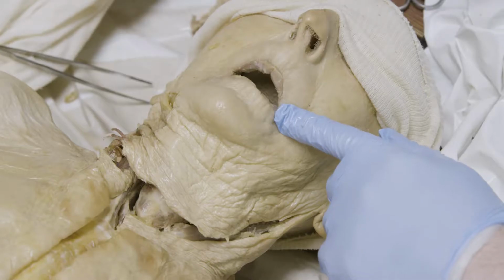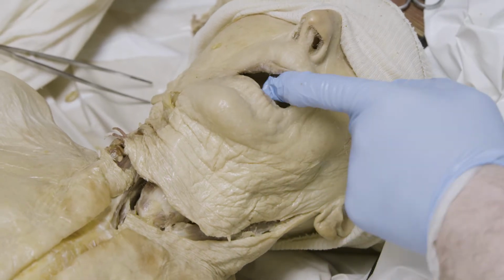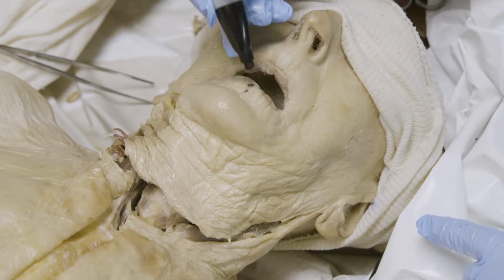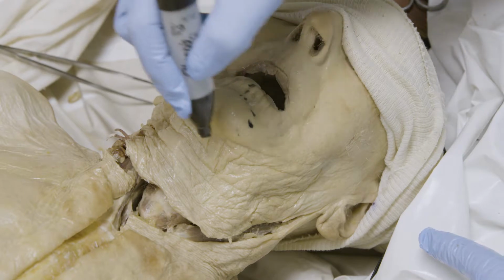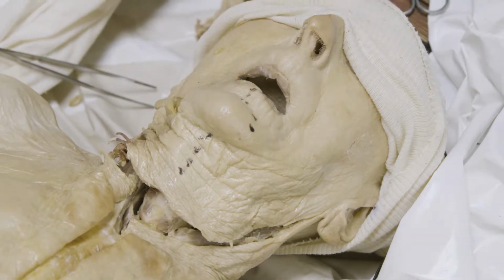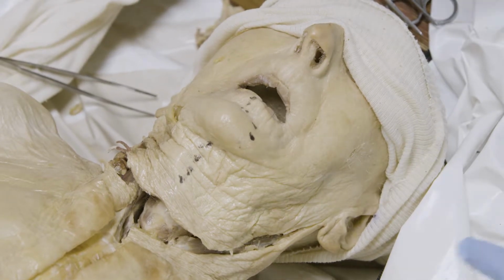To approach the oral cavity, it can be difficult to get the tumors out, in this patient especially because she's post-mortem, everything is very tight and rigid. So what we're going to do is basically what we would call a lip split, which is a good way to get at the oral cavity. So we're going to split the patient's lip, and this is how I'll approach tumors in the mandible.